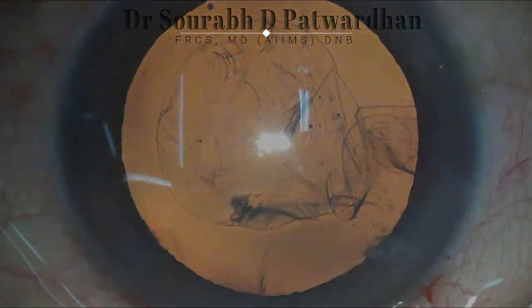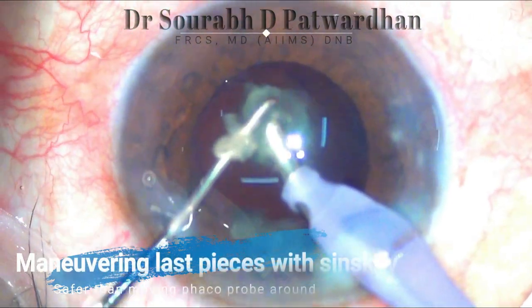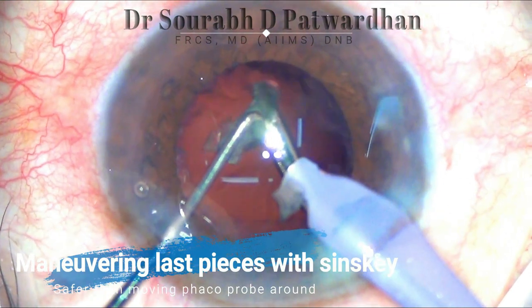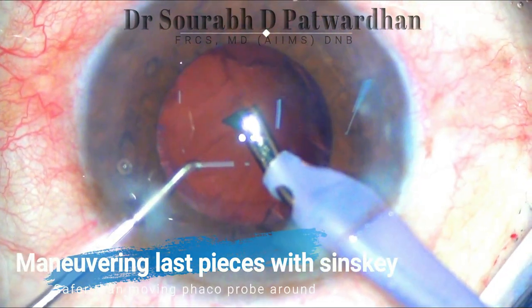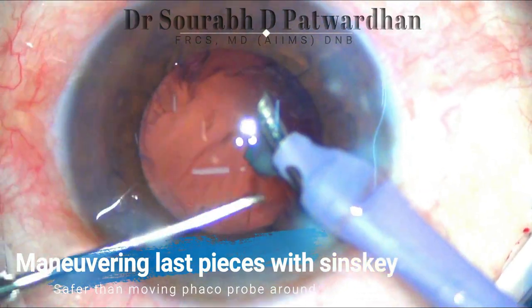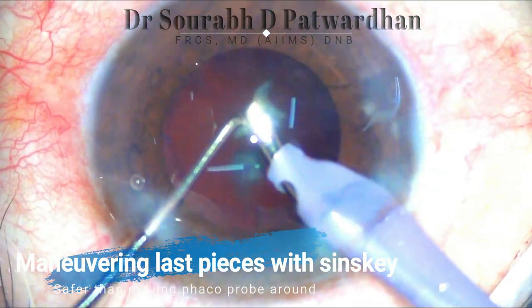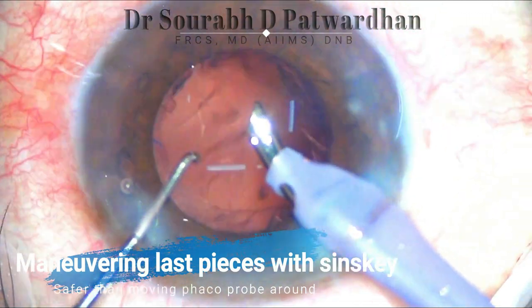Always keep these micro scissors and microcapsulorrhexis forceps in your instrument tray. Always use the non-dominant hand — which is holding the Sinskey — to maneuver the pieces around the FACO probe. It is very important not to move the FACO probe around. The non-dominant hand used for maneuvers reduces the instability of the anterior chamber and keeps the FACO probe in the safe zone, which reduces the chances of posterior capsular rupture. Always train your non-dominant hand for these maneuvers.